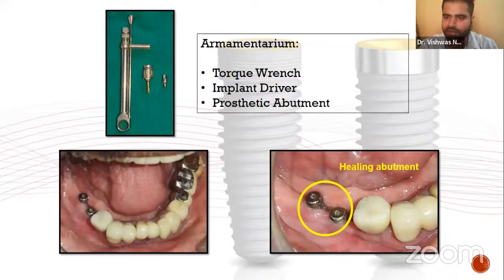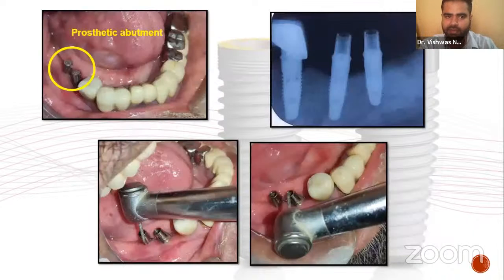The patient was referred to us after the second stage surgery in 45, 46 region, with the healing abutments present. The first step we did was we removed the healing abutment and replaced it with the prosthetic abutment. After that, we took an IOPA to verify the proper seating of these abutments onto the implant head. After that, we observed that there is a slight change in the angulation, which could lead to a non-linear path for our final prosthesis. So we ground the stock abutment with the help of a high-speed air rotor to obtain a single path of insertion.